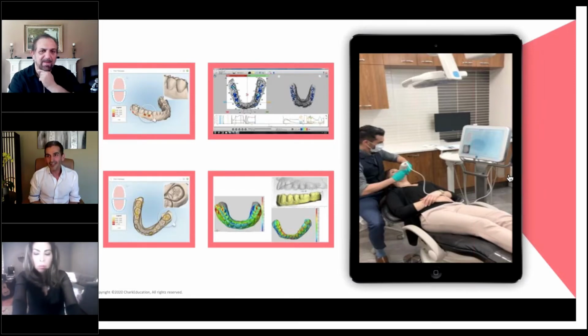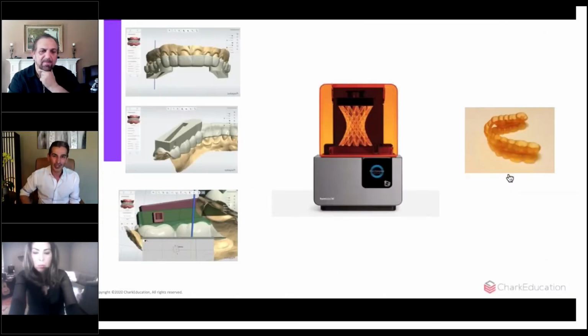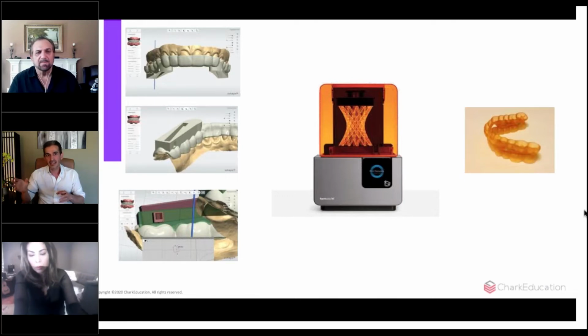What is going to be the norm after that? I am 100% sure we'll be moving towards printing. Not specific printers, just in general, having customized design for customized patients. We did a demo in a talk I gave in 2017 where we scanned a patient on the stage. I gave my talk for 2 hours, and by the end of it, we had the actual appliance printed and delivered it on the stage. It was more of a proof of concept, but that's where I see it going.